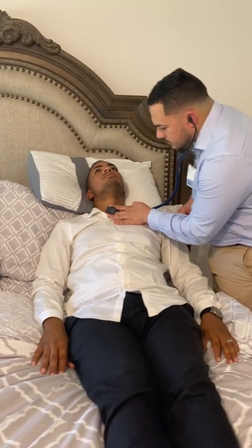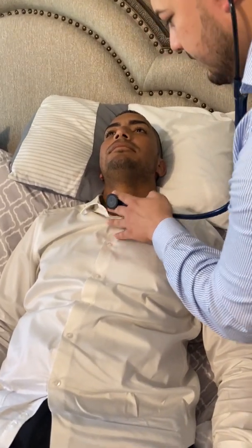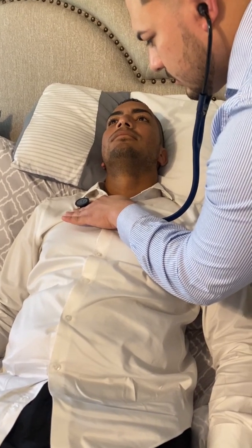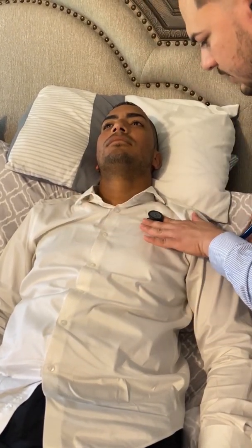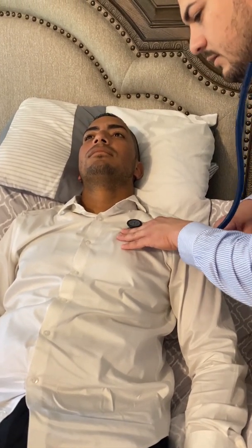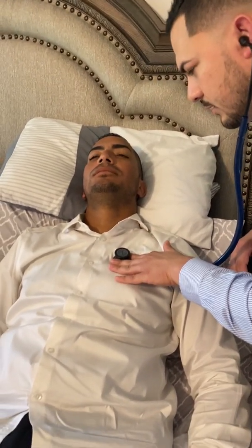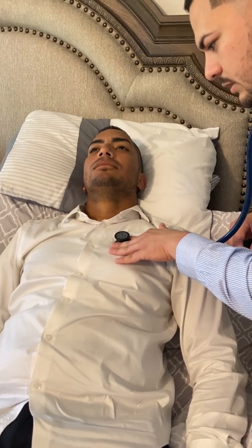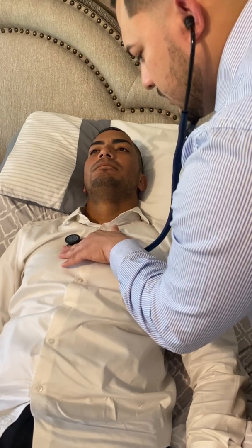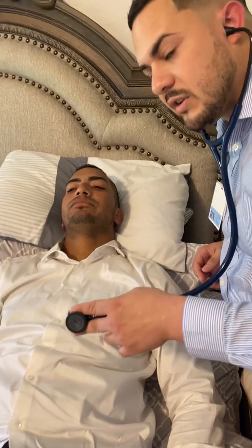breath. Hold it. Now you can breathe. Good. Take a deep breath. Good. One more deep breath. Good. Now I'm going to be listening to the bronchovesicular breath sounds. Take a deep breath. Good. And deep breath. And good. All right. Now we'll be listening to the vesicular breath sounds.